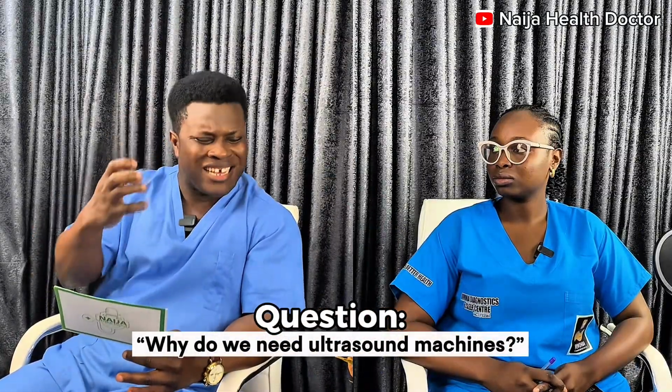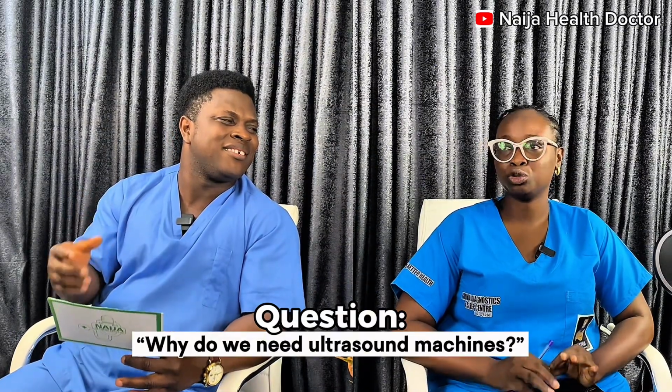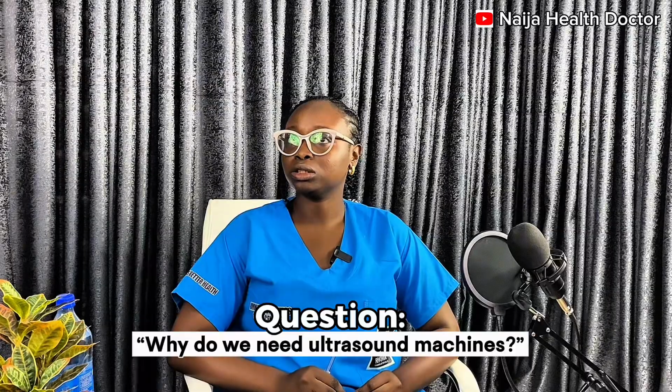What is ultrasound technology? Okay, ultrasound technology is a mechanism that uses the ultrasound machine to send sound waves to a patient's body to view the patient's organs. Why do we need ultrasound machines? Okay, so it's basically to visualize. Ultrasound machine brings visual representation of the patient's organs instead of X-ray.